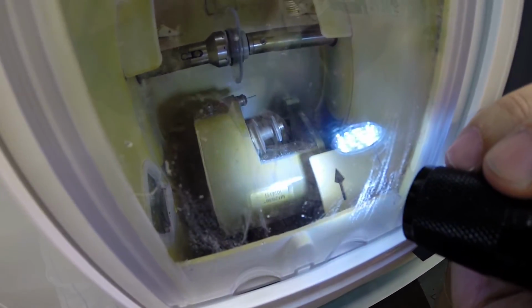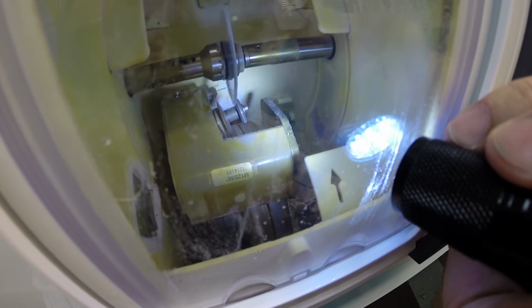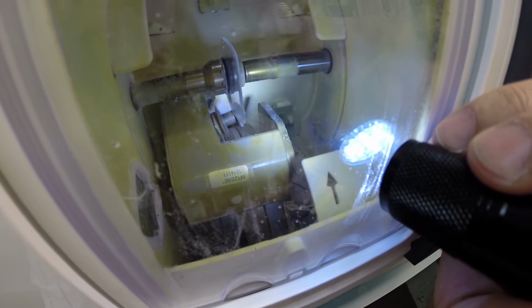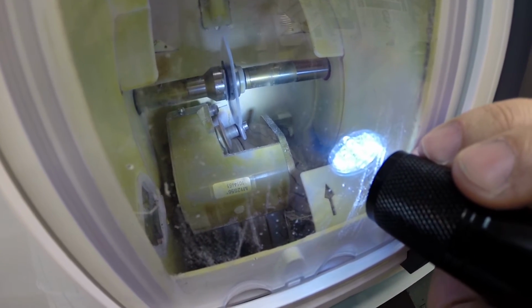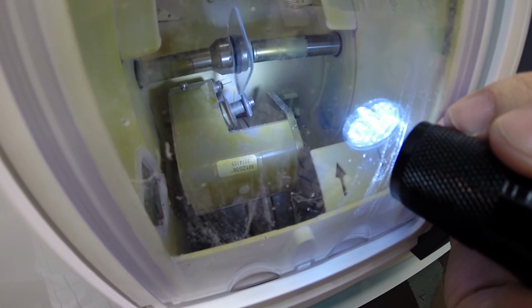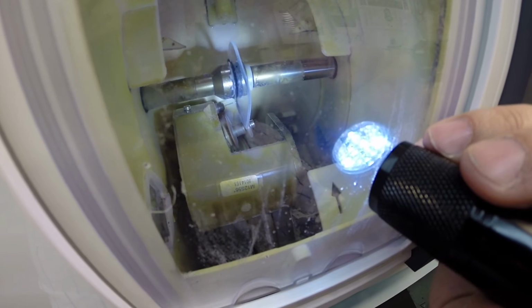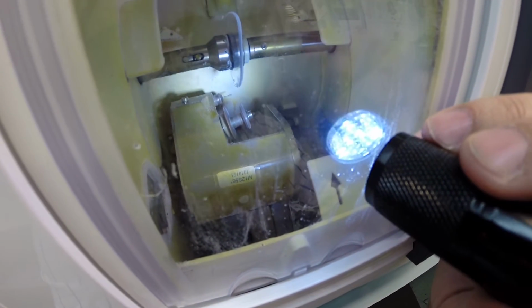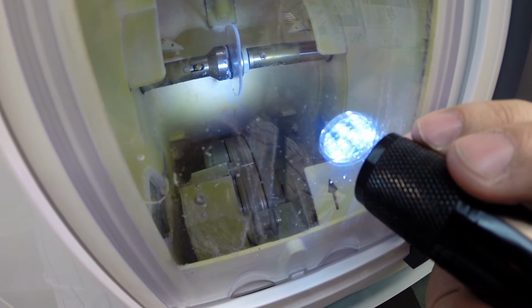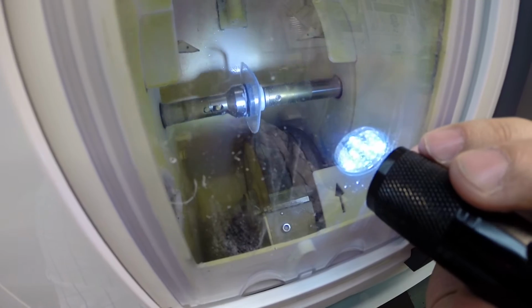Now, a little lever is coming out. At the end of that lever is a spinning wheel, something you would find at the end of a Dremel tool. That is applying the safety bevel to the rear surface of the lens. Now again, this is not going to protrude out of the frame, but should you have any edge thickness in the stronger prescriptions, that becomes more critical, and should it come into contact with the cheek, it'd be nice and smooth.